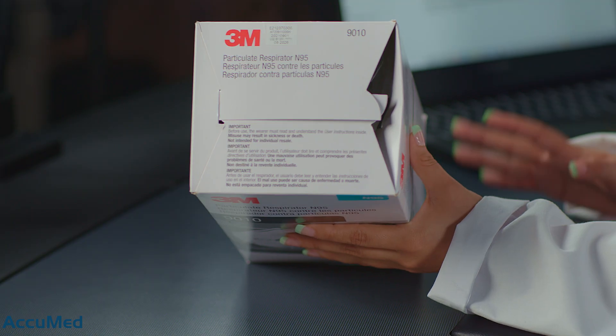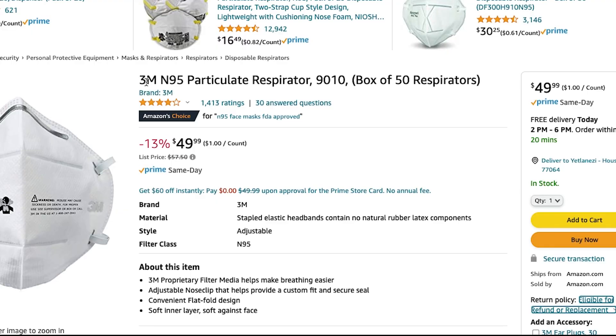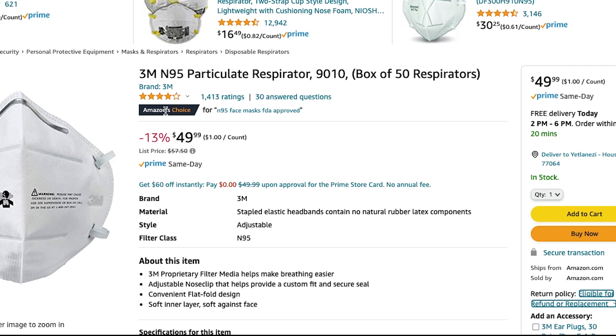Hello everyone and welcome back to the Acumet channel. Today we're going to be testing another 3M — this is a 3M 9010 N95 respirator. Let's go over the listing before we try these on. These are the 3M N95 particulate respirator 9010, in a box of 50.